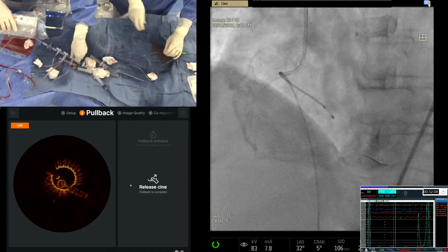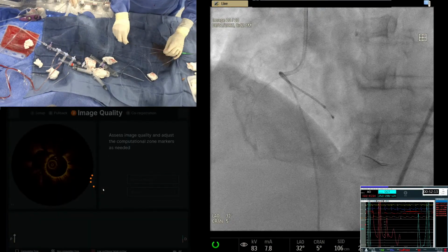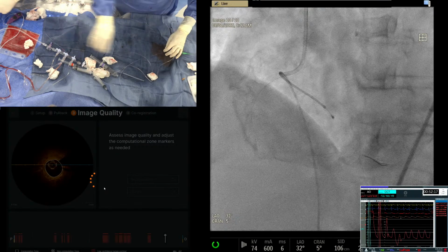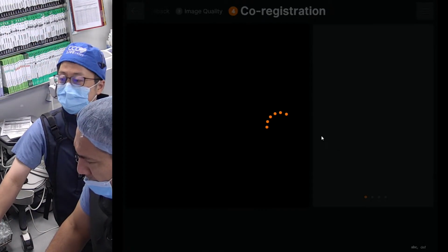Why don't we see blood pressure? You should be seeing pressure. It only comes from, no, I know. So now we successfully get the image. So now it's thinking about the co-registration. First, we accept and keep the image. Then talking about how you do co-registration. Yeah, sure.